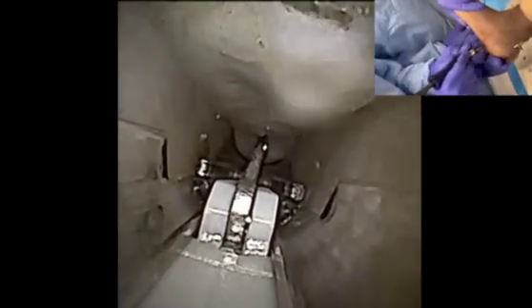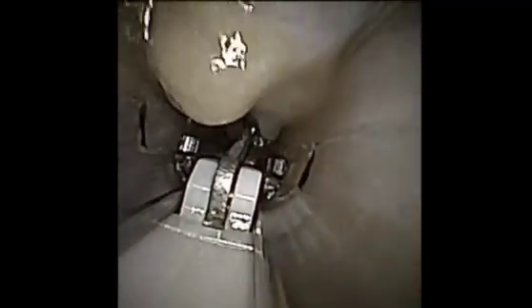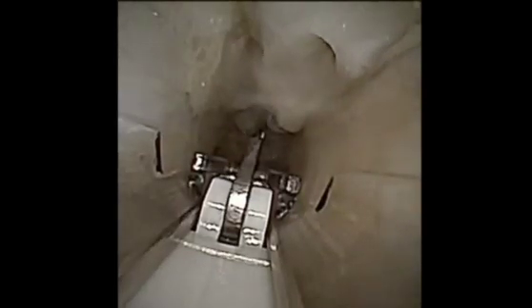The release is complete when fat and underlying intrinsic muscle is visualized across the width of the release. Multiple passes with the endoscopic release system may be required to ensure complete release. It is important, though, to be careful with an overly aggressive release, which can increase the risk of lateral plantar nerve damage. The wound is then irrigated and the skin is closed with nylon sutures.